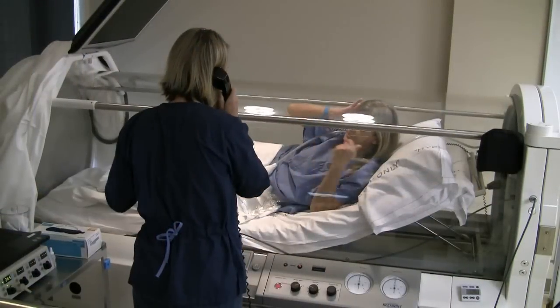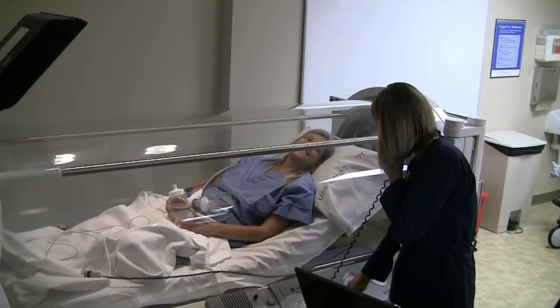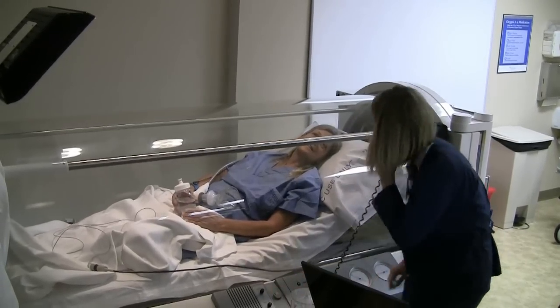This is one of those situations where it can work very effectively and make a significant difference in her outcome. We've got a beautiful facility, but what makes it go is the people. We've got nurses that have been experienced in this for a long time. We're fortunate to have a hyperbaric tech who has many years of experience — she was at Baylor in Texas and just happened to move to this area.